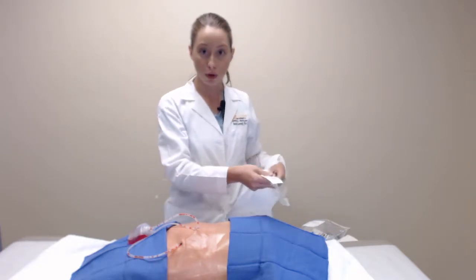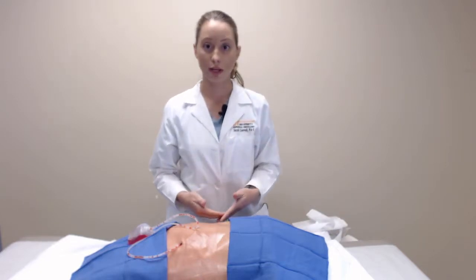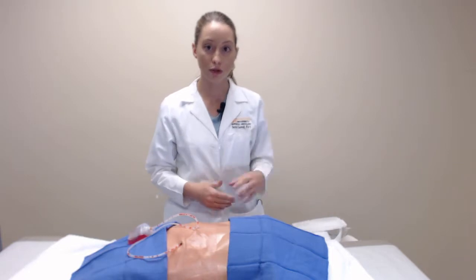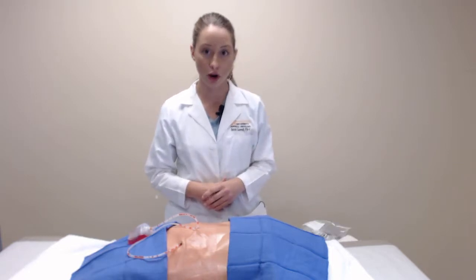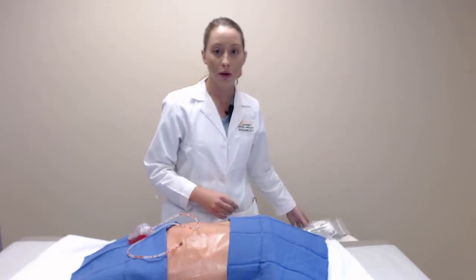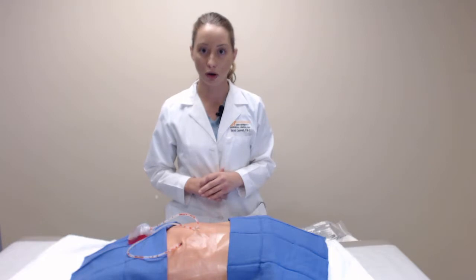I recommend keeping one waist belt for the shower, as you do need to make sure that your drain stays supported even in the shower. So you can treat the waist belt just like a towel and let it dry. The next part are the gloves. Before doing anything with your drain, it is important that you wash your hands and wear gloves.